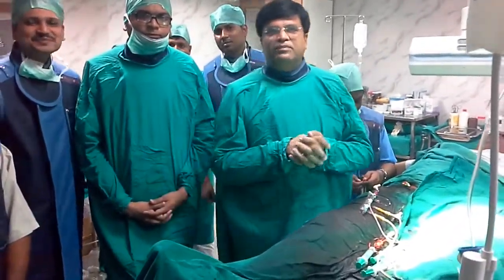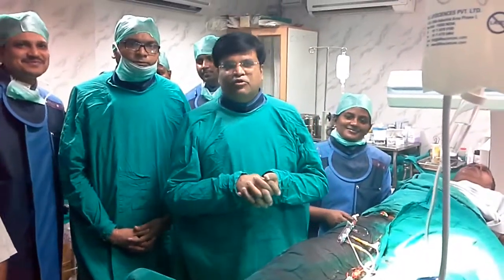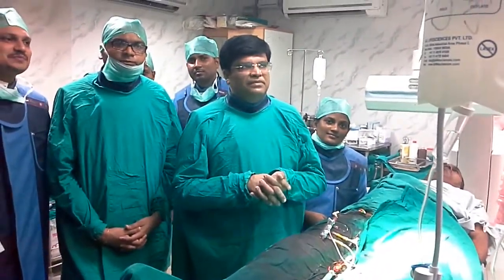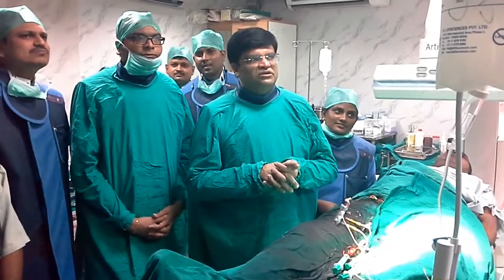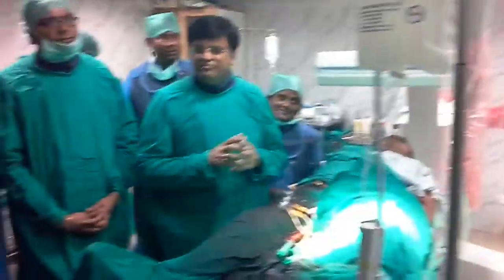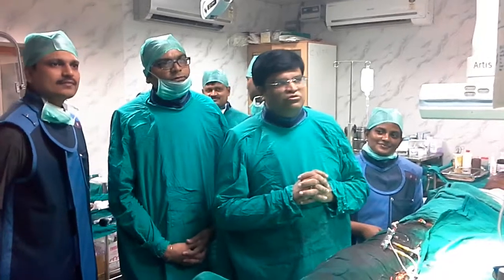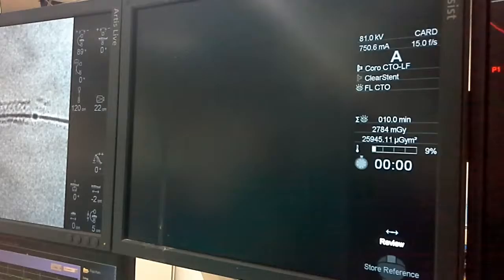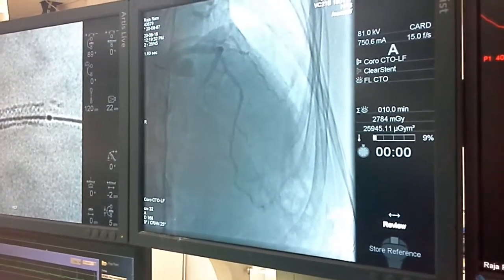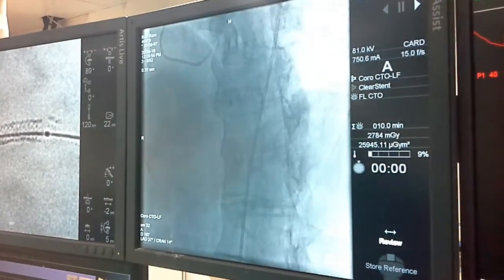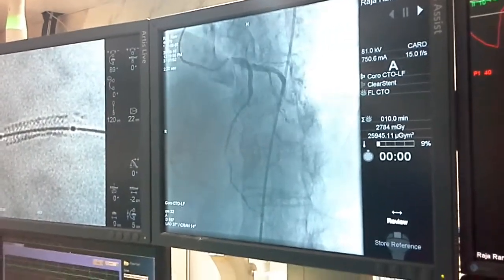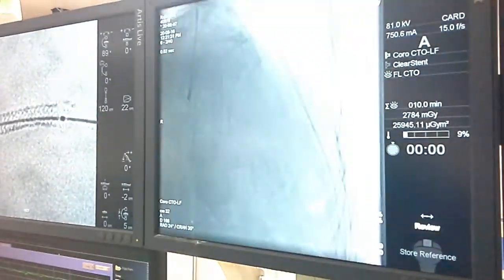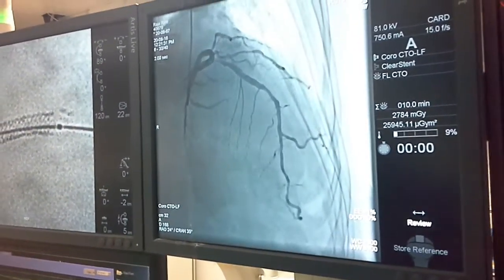We have done the first case here. We have already planned for more than 10 cases — about 11 cases. The first case turned out to be a single vessel disease with two lesions in LAD. This is the left shot showing the proximal LAD lesion and the mid LAD lesion about 70%, and proximal LAD about 60–80%. The patient has angina. Considering that this patient has almost normal circumflex with diffuse disease, we thought that the culprit lesion is only LAD.